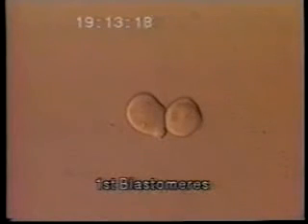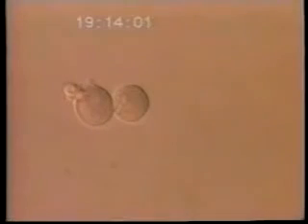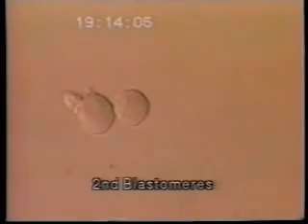Detailed studies in experimental animals, not in humans, have clearly demonstrated that when you remove 1 blastomere from a 4-cell embryo, you will severely hurt that embryo. But removing 1 or 2 cells from an 8-cell embryo will not hurt its future development. Here you see the blastomeres from the first embryo lined up nicely and ready for genetic testing. This is from the second embryo, 2 beautiful intact cells, each of which is potentially able to develop into a baby, and the single blastomere from the third embryo.